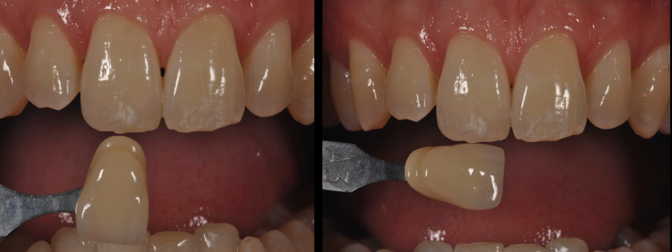But if we place the same tab horizontally, things change. Look how now this shade tab matches the shade present in the middle third of the tooth. Same shade tab, same amount of ambient light, and same set of eyes.